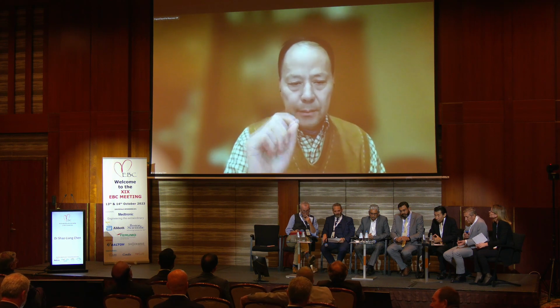Yeah, I think I can show this slide again. Can you see my slides? Actually, after dilating the side branch, if the side branch TIMI flow is less than 3, or if there is a type 3 dissection in the side branch, we will deploy an additional stent in the side branch. So it's independent of the side branch diameter stenosis.